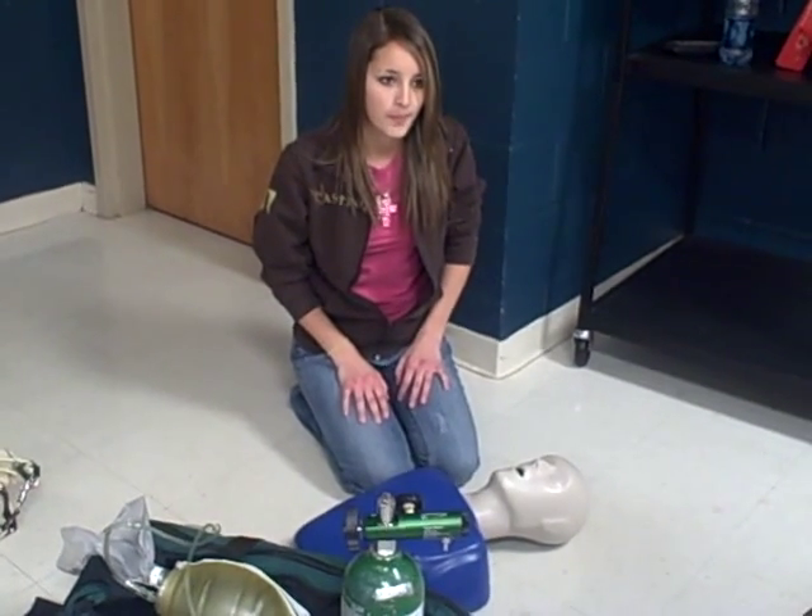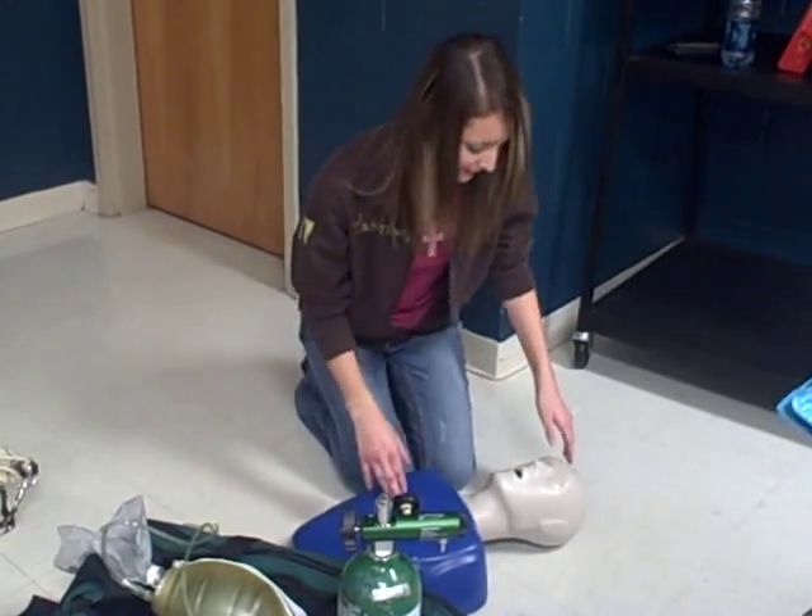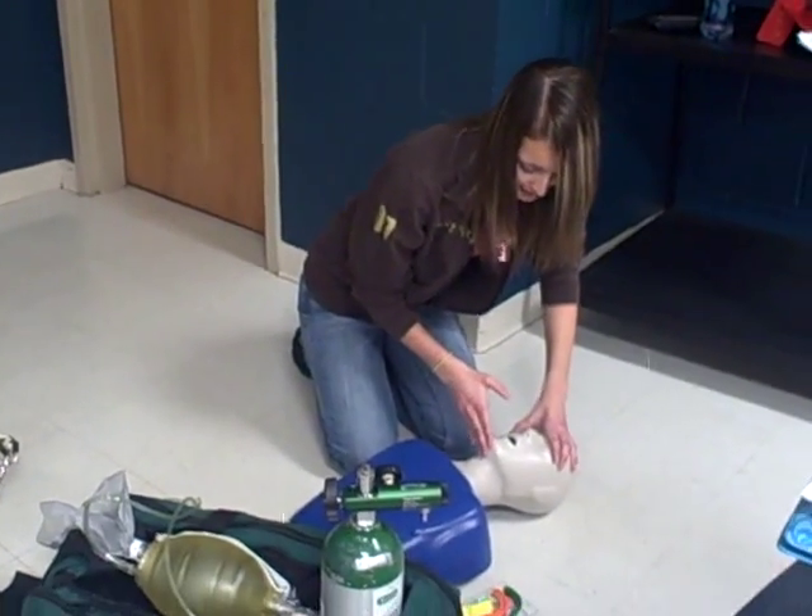We're performing the bag valve mask skill. BSI for my buddy and I. We're going to do the head tilt, chin lift to open the airway.